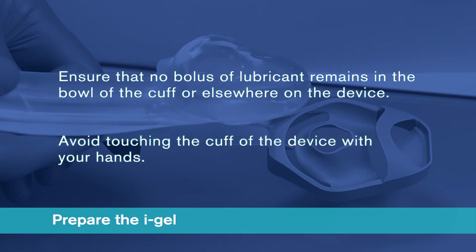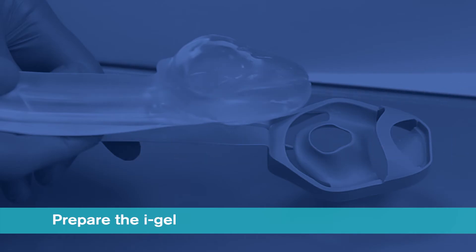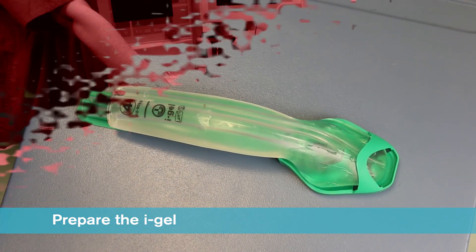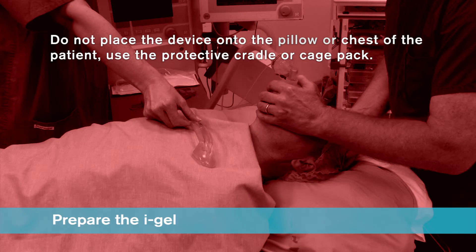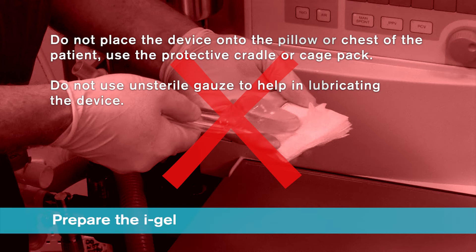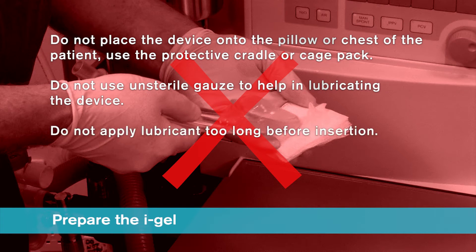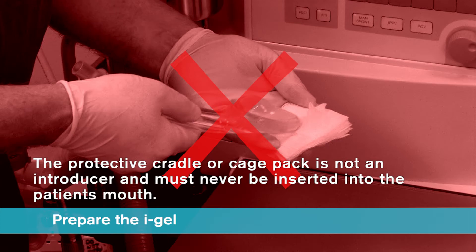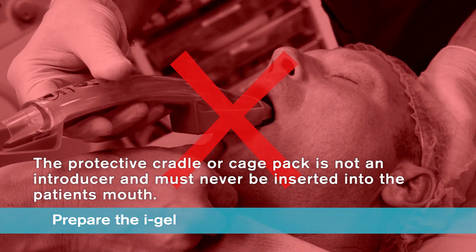Avoid touching the cuff of the device with your hands. Place the iGel back into the protective cradle or cage pack in preparation for insertion. Do not place the device onto the pillow or chest of the patient. Always use the protective cradle or cage pack. Do not use unsterile gauze to help in lubricating the device. Do not apply lubricant too long before insertion. Always ensure dentures or plates are removed from the mouth before attempting insertion. The iGel must always be separated from the protective cradle or cage pack prior to use — these are not introducers and must never be inserted into the patient's mouth.